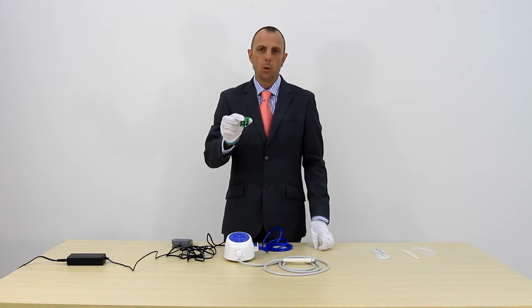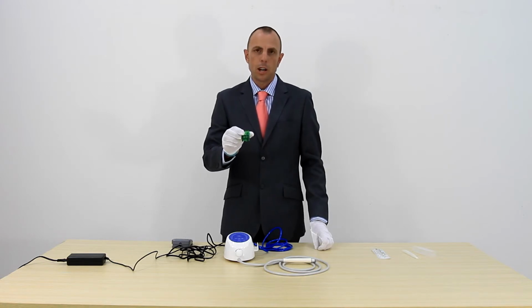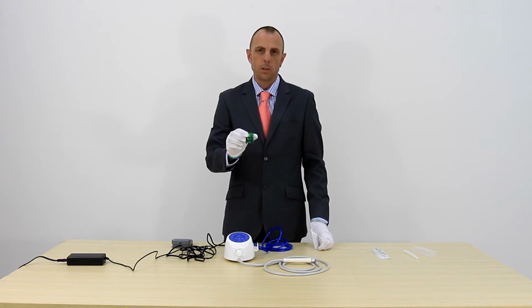It's very, very important that you always use this torque wrench when attaching the tips to the handpiece. If you were to use another type of tool such as a spanner, there's a good chance you're going to damage the threads in the handpiece, which will then make your handpiece unusable. So always use the torque wrench.